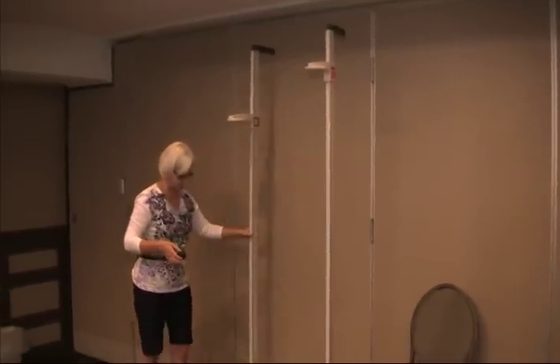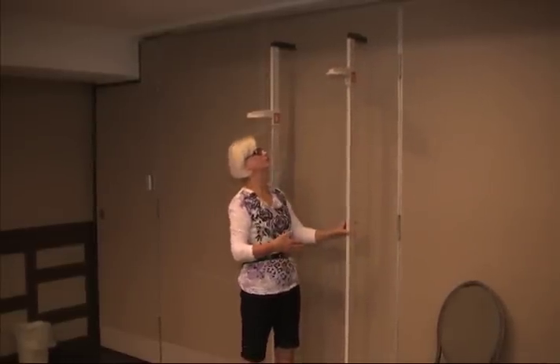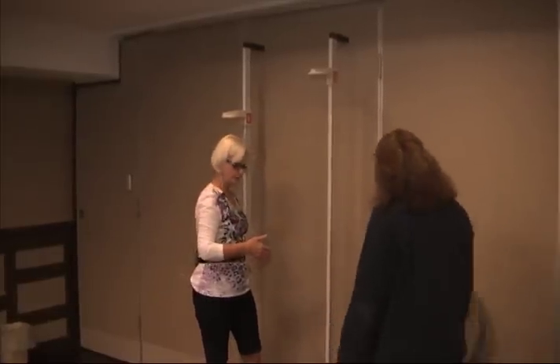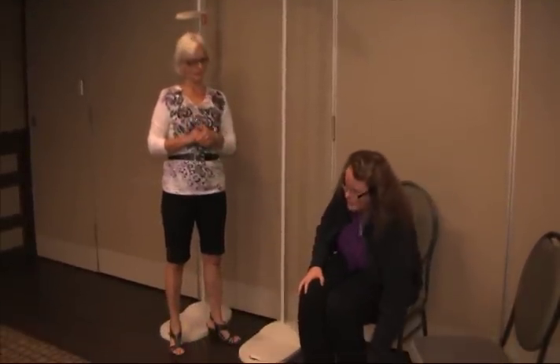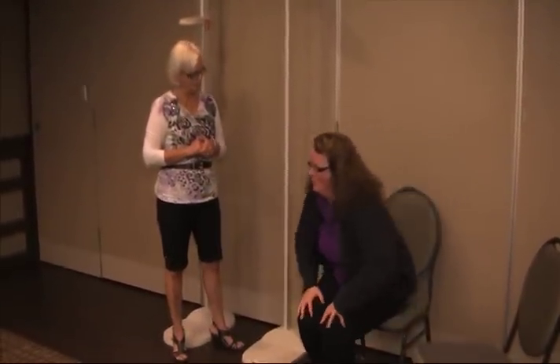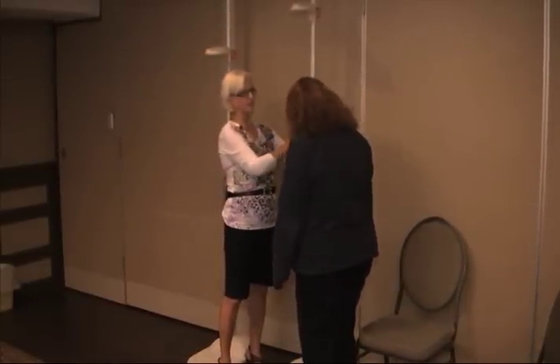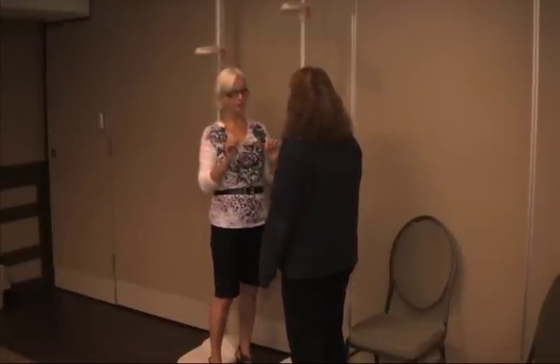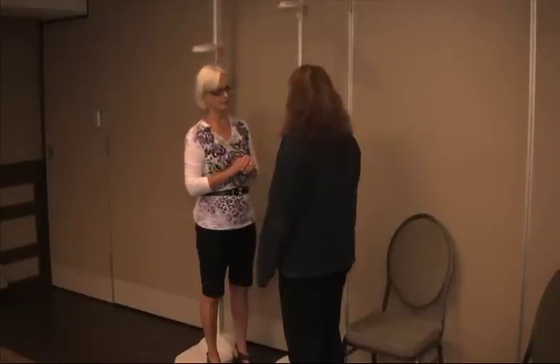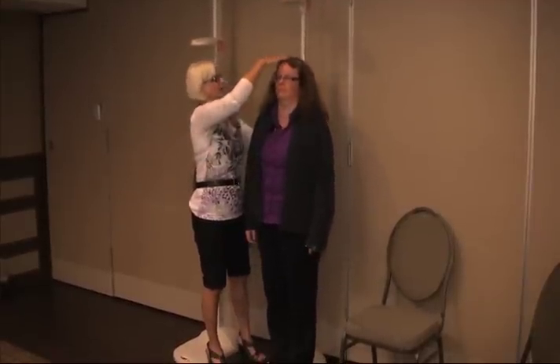So now we need a volunteer to have their height measured. I'm going to back the stadiometer up to a wall for stability. No shoes — have to take your shoes off. We want this to be accurate. What I'm going to ask you to do is stand with your back against my pole, and then I'm going to slide it down. We're going to do it three times, record what they are, take the average, and that will be your height today. Back up, step up, stand tall, look forward, eyes level.